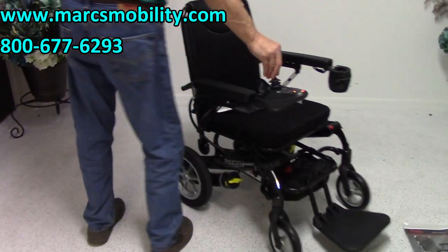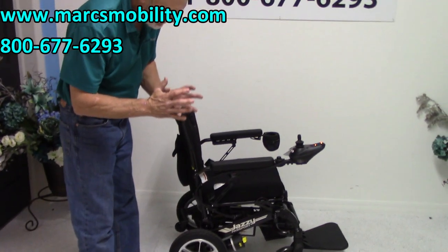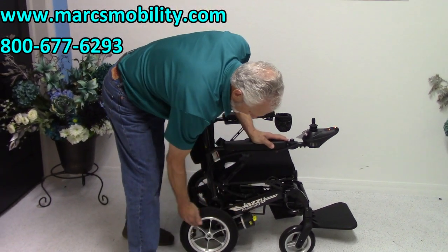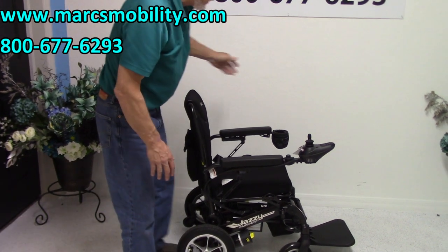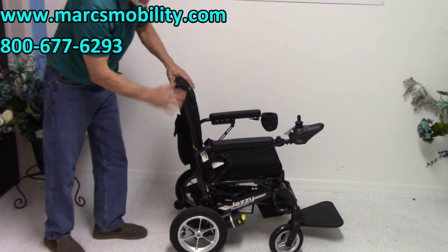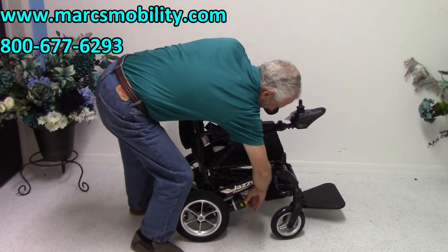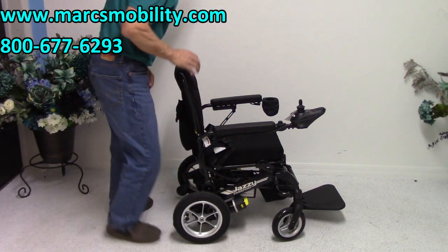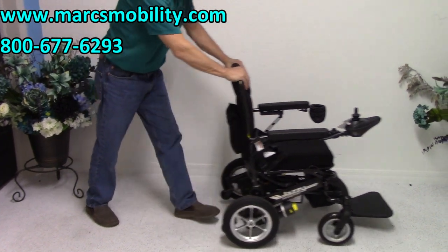You have two motors on this chair — these are not cheap little hub motors. These are actual motors with cylinders, and each wheel has its own motor. If you turn the power off and want to push the chair manually, you'll see it resists because it's in gear. But there's a little yellow lever in front — if you turn the lever down on both sides, now you can push the chair freely.